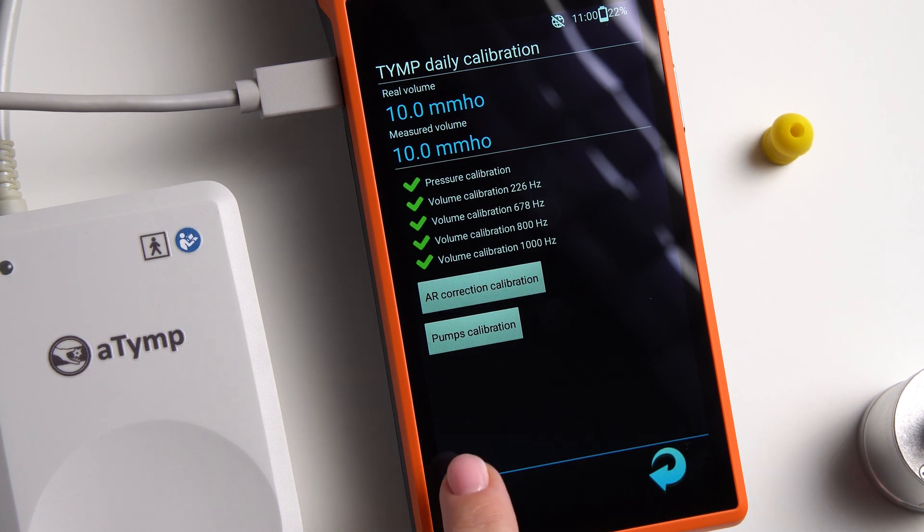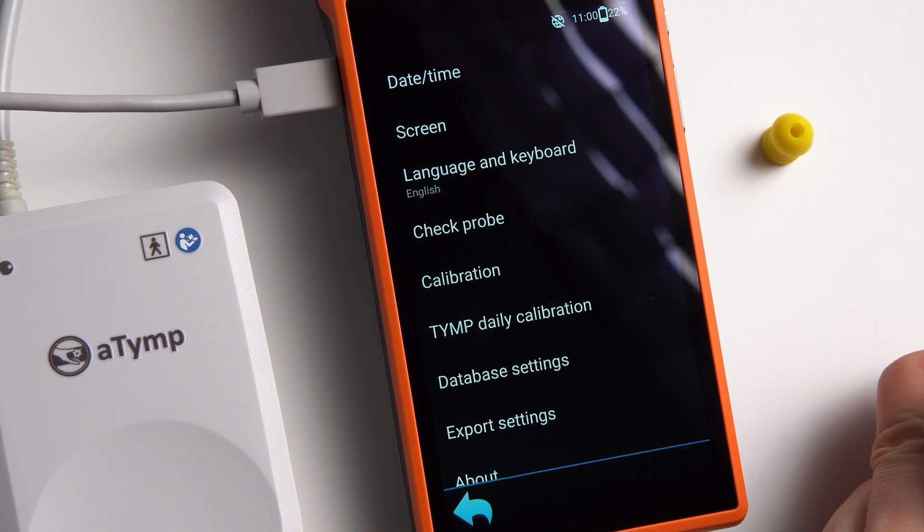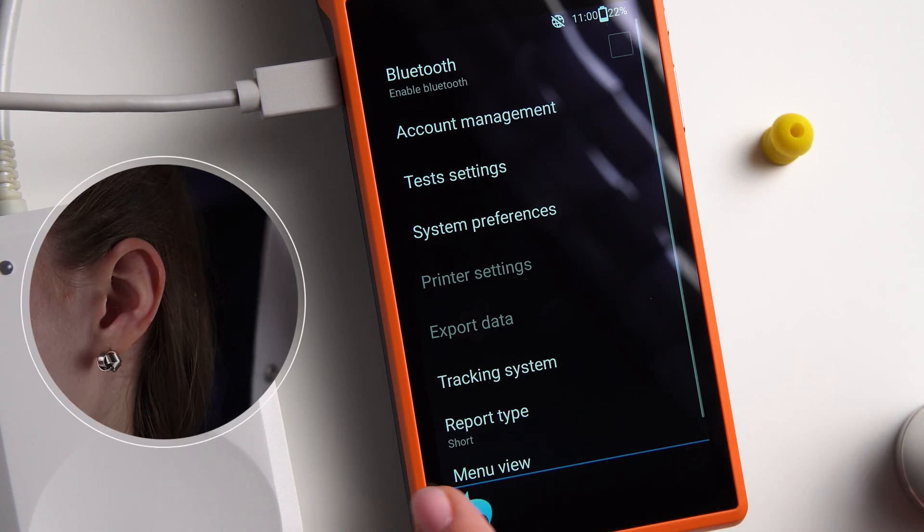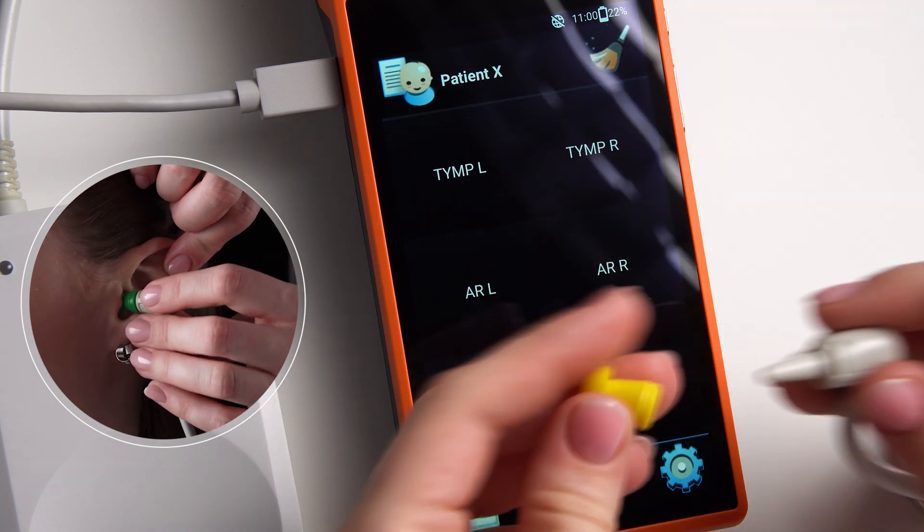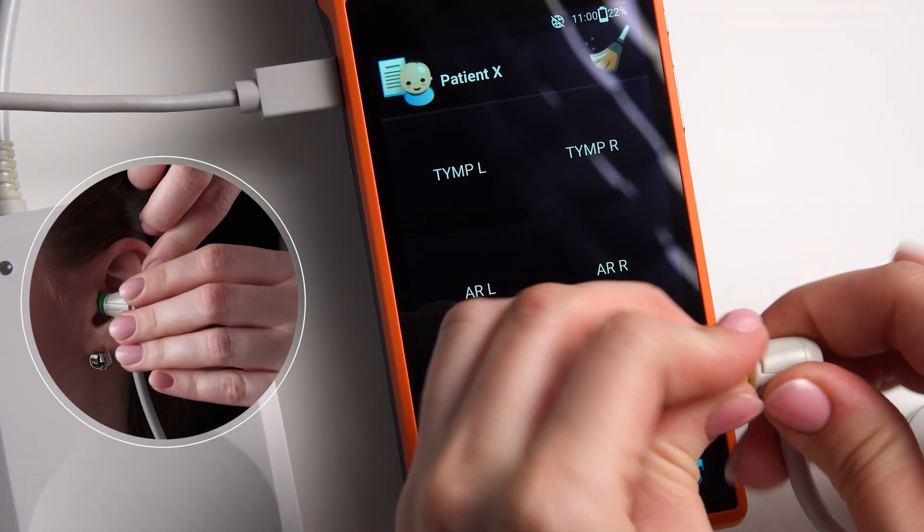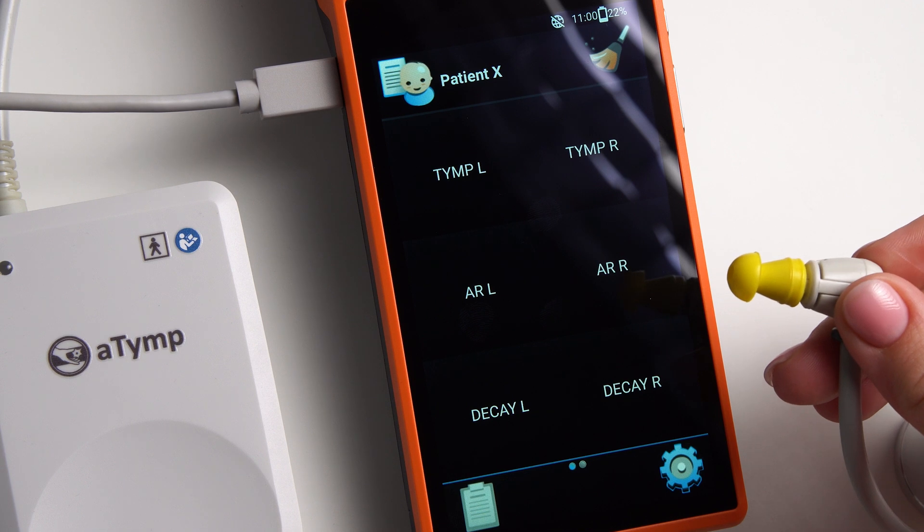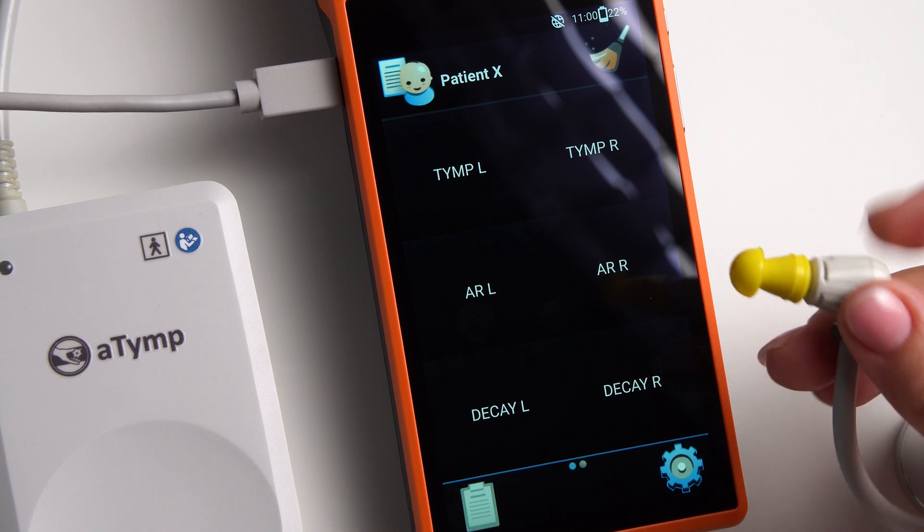Next, select a suitable sized ear tip. Firmly put it on the probe tip and insert it into the patient's external ear canal. For better fixation, you can use a special handle. It is not recommended to hold the probe with your hand during the examination.